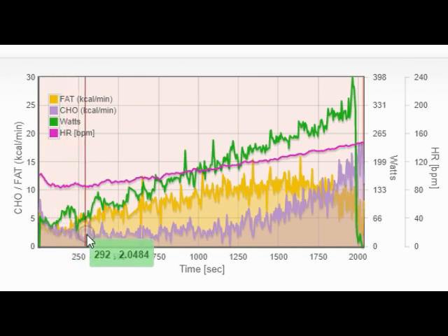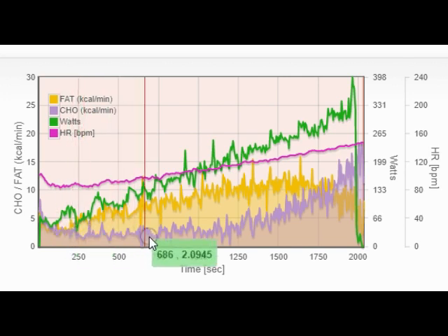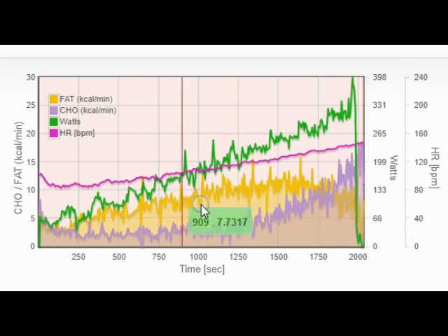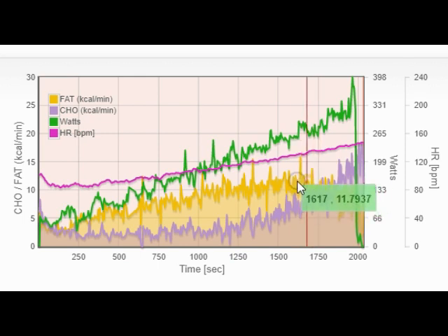And then once you get walking, you're over your response to whatever you're starting up, your new activity. Sugar should go down to where it belongs and sit down there as a minimal substrate for this activity, and fat should come up. So you can see my total activity was primarily funded by fat, totally by fat through here. So sugar came up as the intensity came up. Fat peaked out right here. That's your max fat oxidation.